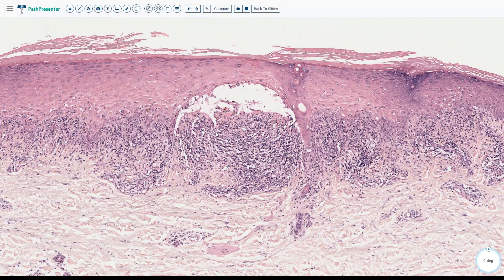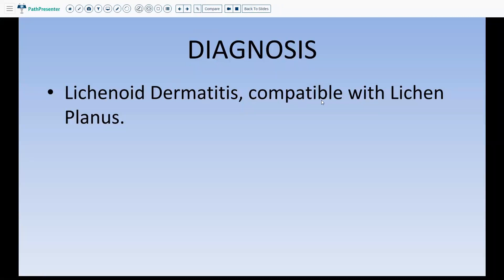Because this infiltrate is attacking the dermal-epidermal junction, sometimes there is almost a bulla formation known as the Max-Joseph space. This is just because the DEJ is being attacked and causing some dissolution of the basement membrane — not always present, but you might sometimes see it in lichen planus. If you see all these features, you can sign this out as lichenoid dermatitis compatible with lichen planus. We say 'compatible with' because if this was a single lesion, it would be a benign lichenoid keratosis with the exact same histology. So it depends on the clinical history.